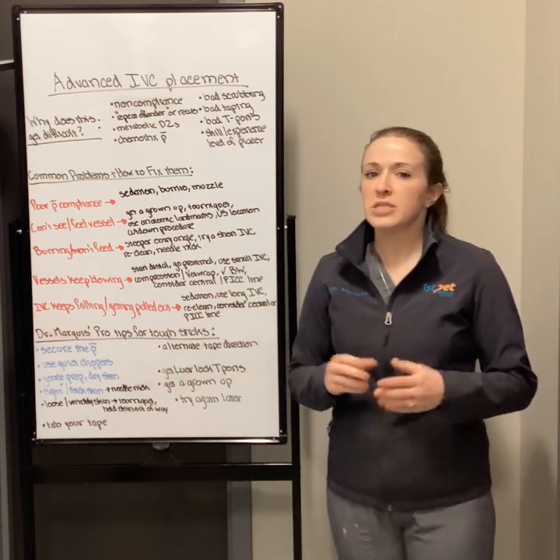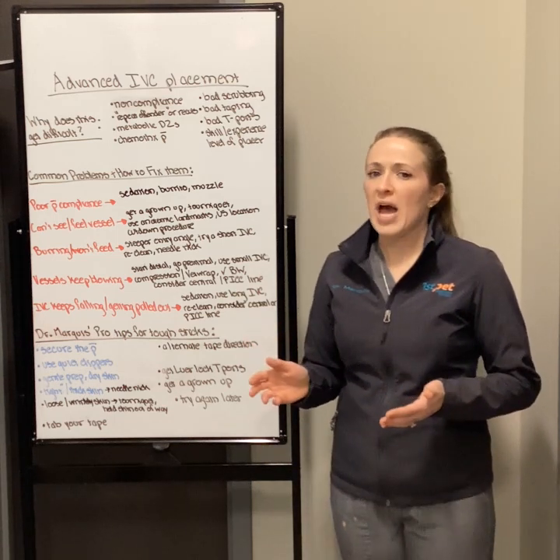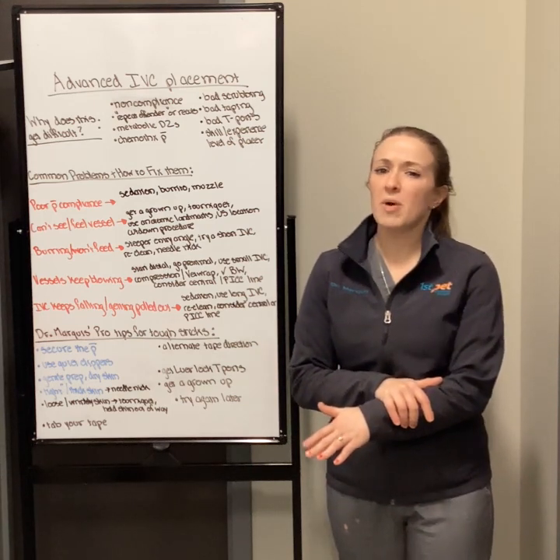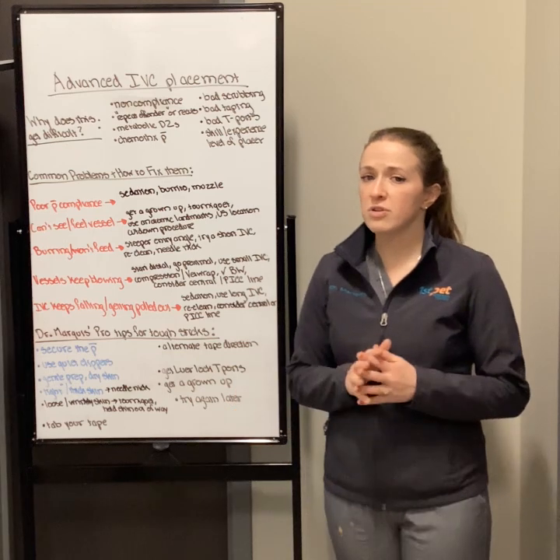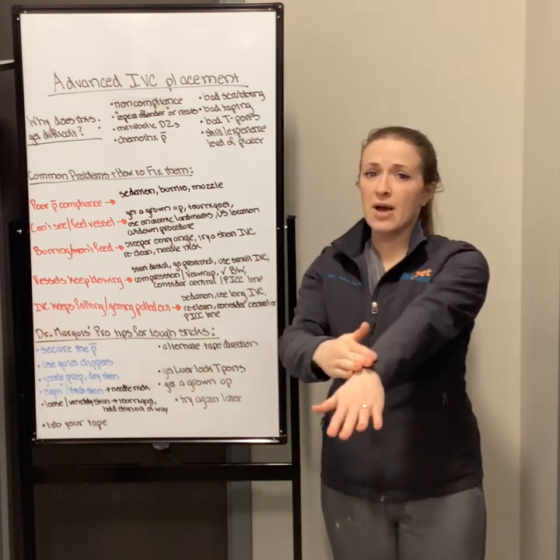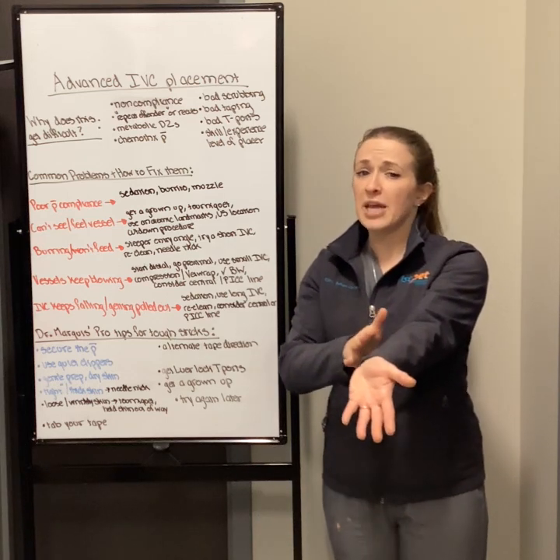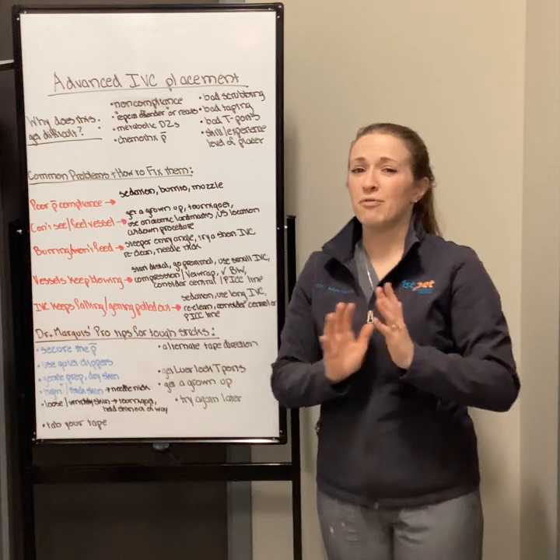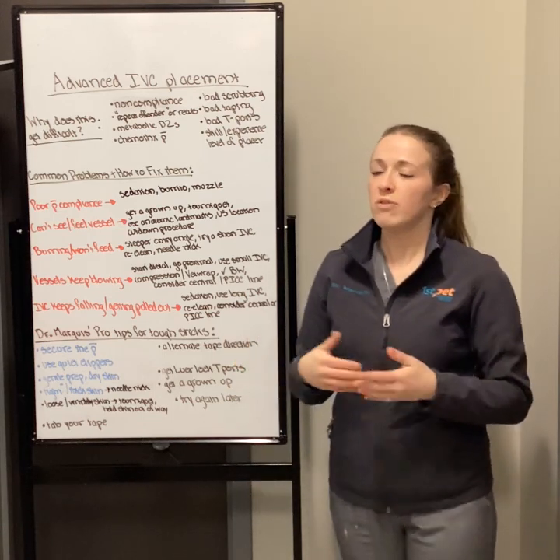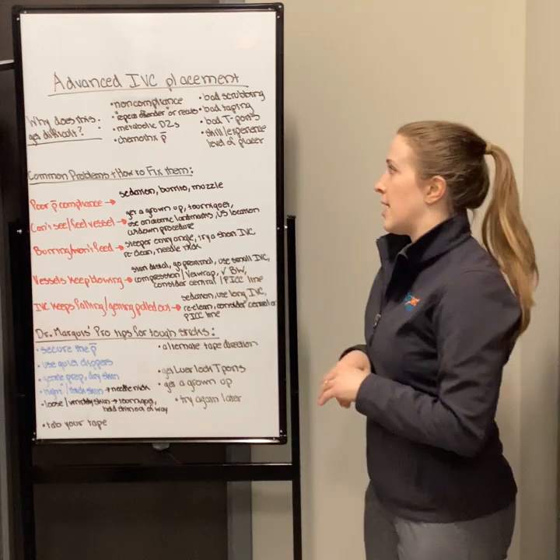Chemotherapy patients. This is kind of going along with recuts or repeat offenders. These are dogs or cats that have had injectable chemotherapy through a catheter. That usually means they're going in every week or two to get IV catheters. What usually happens in this situation is that instead of you seeing just one vessel down the front of the leg, the cephalic, these dogs and cats will pop up tiny little accessory vessels, kind of all around. And that can make seeing the normal vessel very difficult. And because their skin is scarred, it makes passing the catheter very tricky.